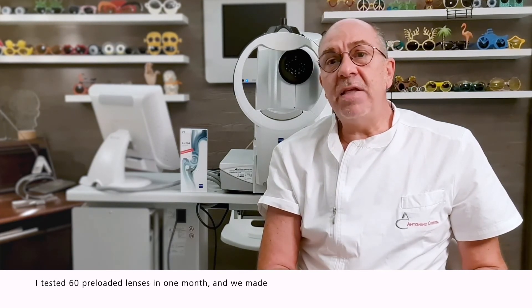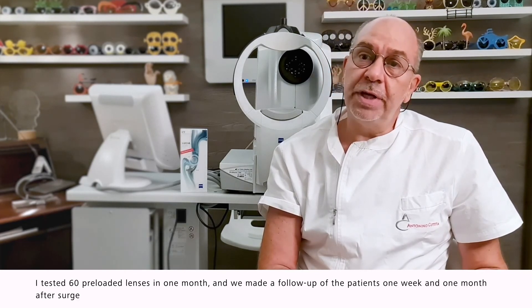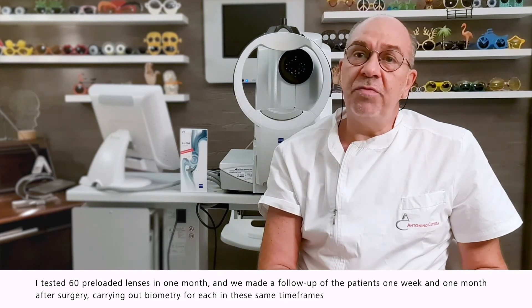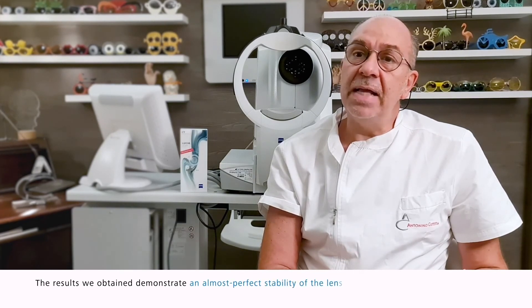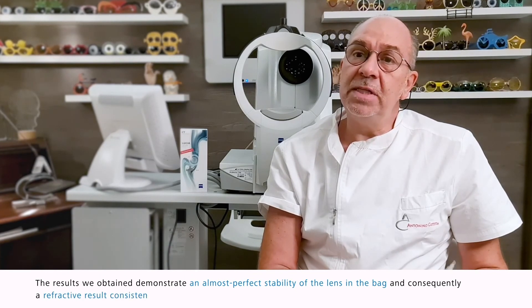I tested 60 preloaded lenses in one month, and we made a follow-up of the patients one week and one month after surgery, carrying out biometry for each patient in these same time frames. The results we obtained demonstrate an almost perfect stability of the lens in the bag, and consequently refractive results consistent with the preoperative calculation.